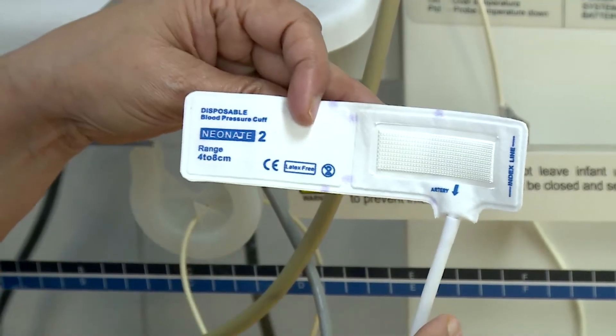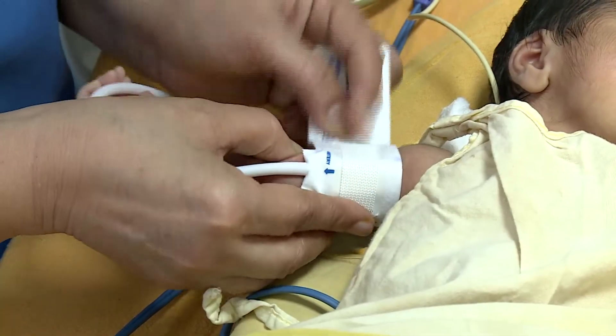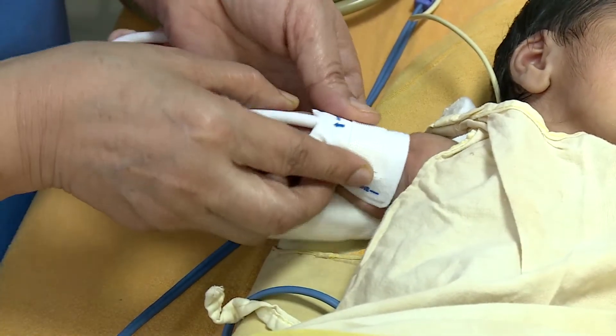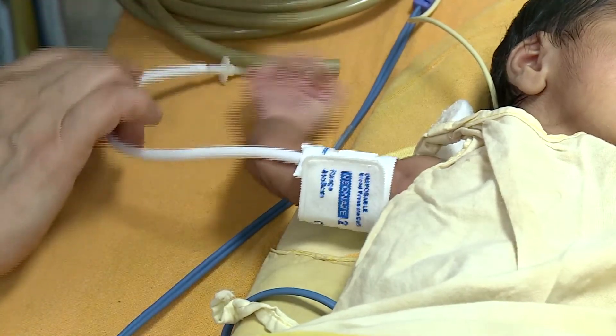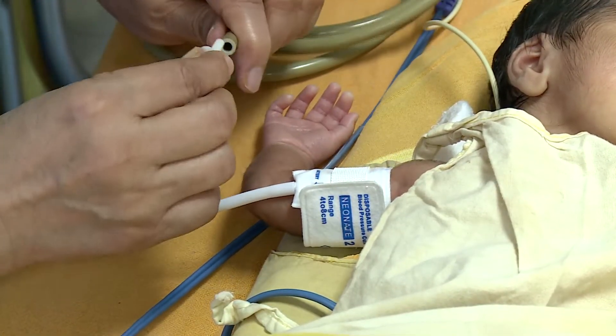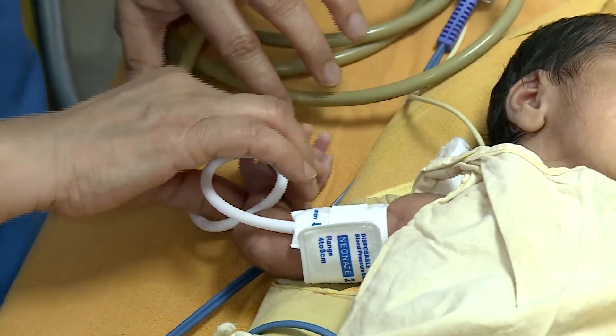To ensure that the reading is reliable, squeeze all the air from the cuff before applying it on the limb. The cuff bladder should ideally encircle the entire arm. The measurement should be performed at least one hour after feeding or any medical intervention. Tie the BP cuff and wait for 15 minutes while keeping the baby calm.